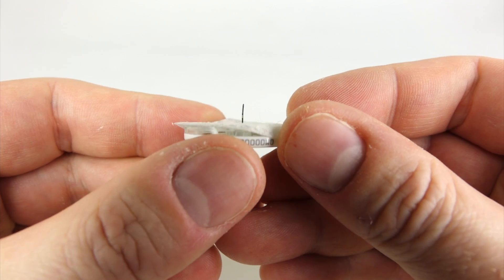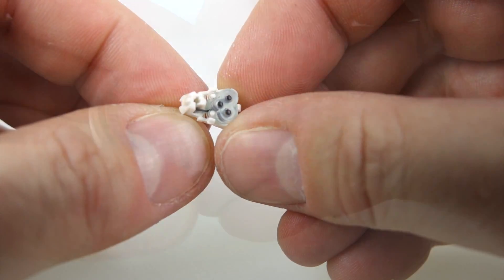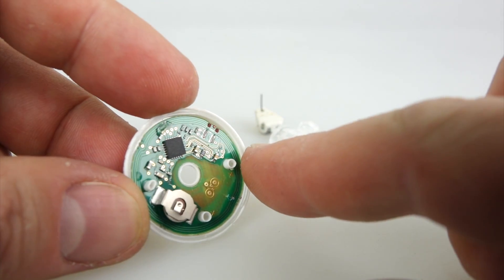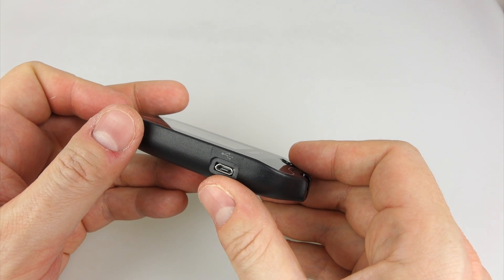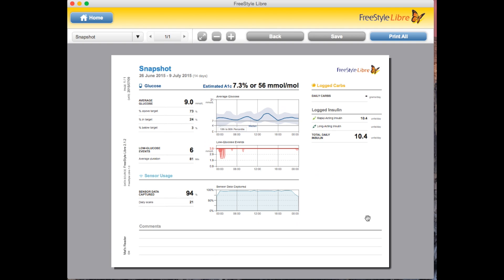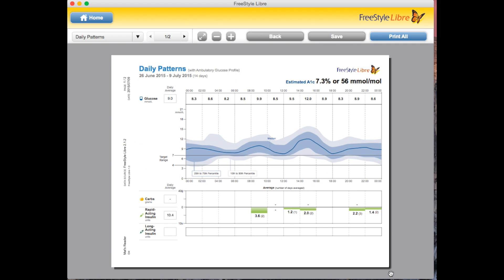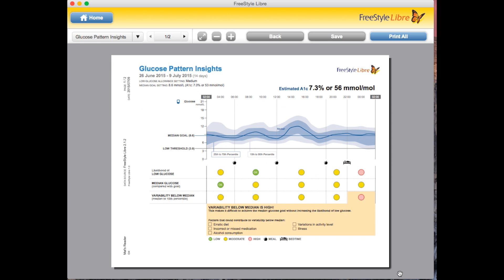The filament, as you can see here, is actually flexible — you're not putting a solid needle into your arm; it does bend around with your arm. I'll take this apart to show you what's inside: there's a battery — a traditional watch battery — and a few little bits of electronics, presumably some memory in there as well. The device itself has a micro USB port that enables you to charge it, which you may need to do more frequently because of the big screen. You can also plug it in to access settings or generate reports to take to your health professional — some really nice reports come out of the software, which is downloadable from the Freestyle Libre website and available for both Windows and Mac.